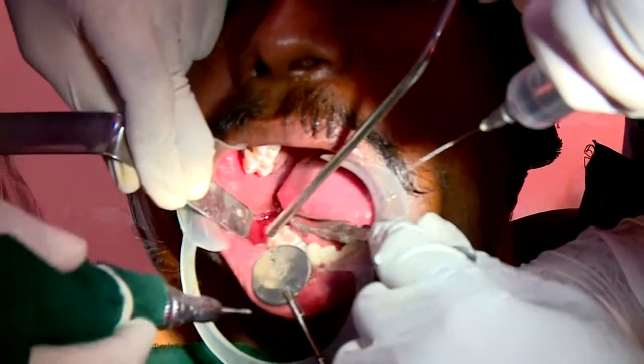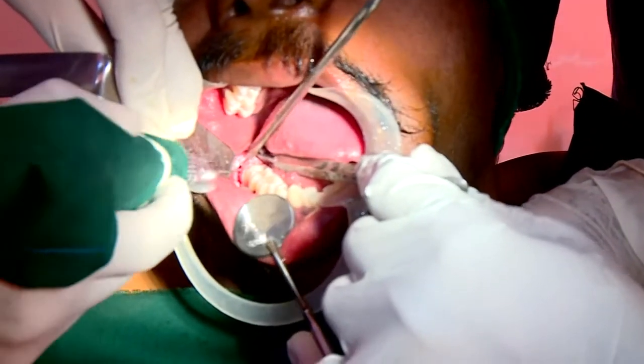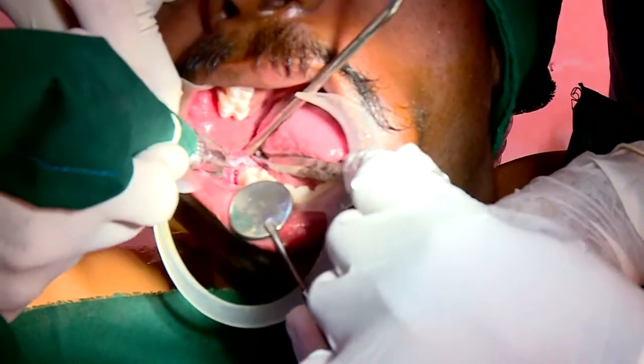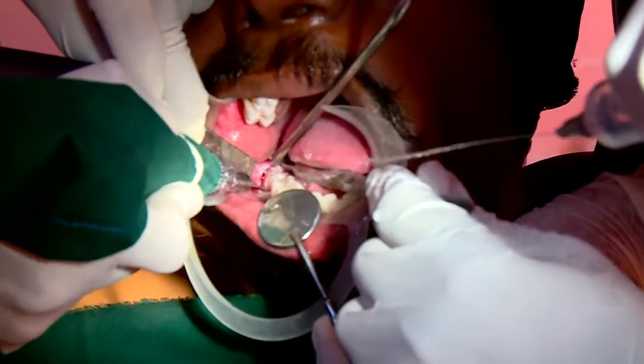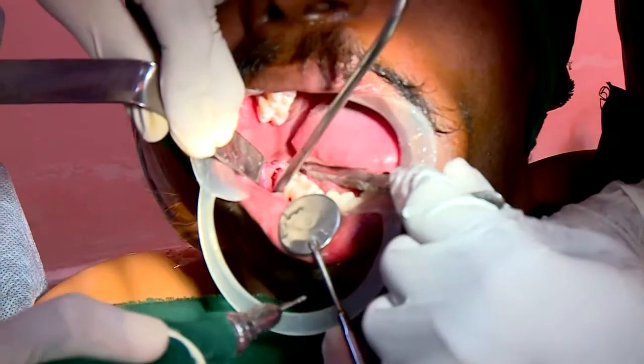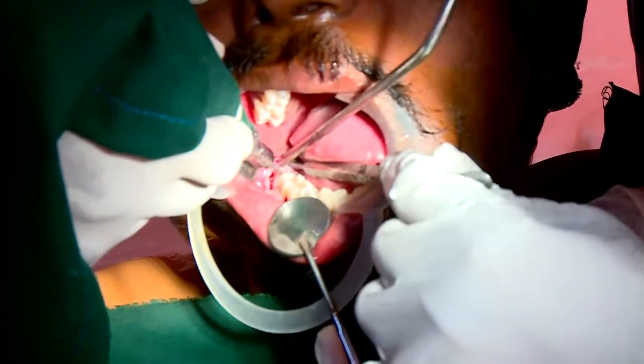Always see that the lingual nerve is protected. If you are not taking the tooth out, you will not use the instrument like that. You can just remove the instrument out, or by using the distal bone remover, you can place the instrument as well.